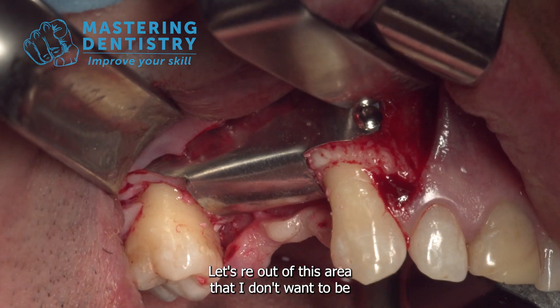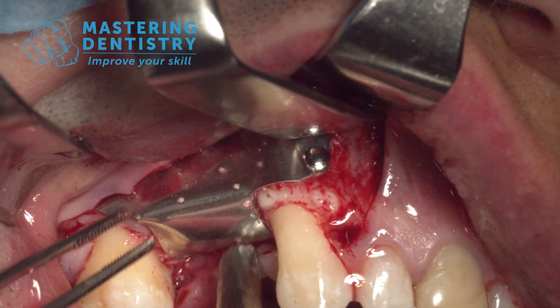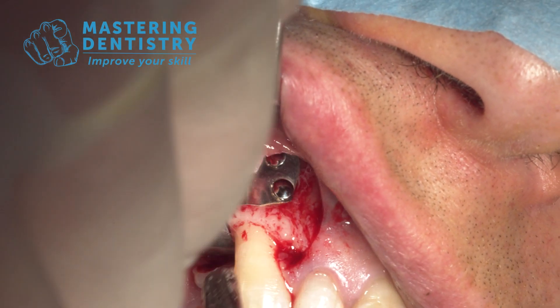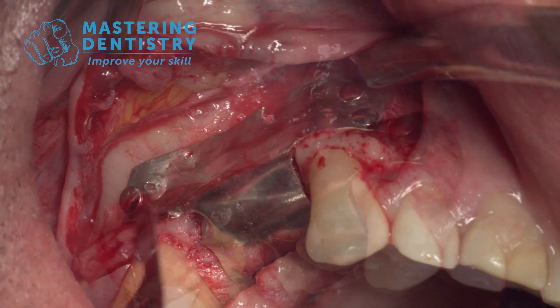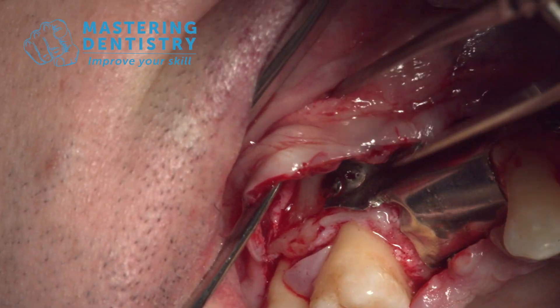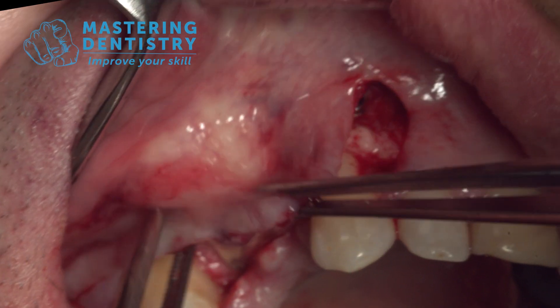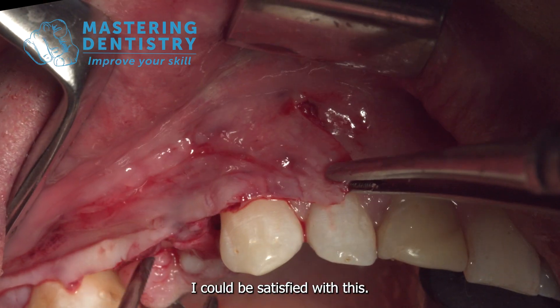Let's re-secure this area that I don't want to be uplifted — I bend it like this. Let's dissect the periosteum. Here I am extending the detachment a bit and spreading the two areas that I separated at the periosteal level. I would say I can be satisfied with this result.